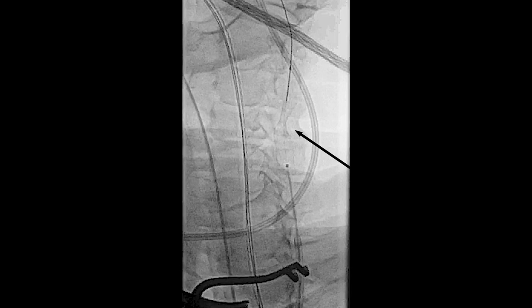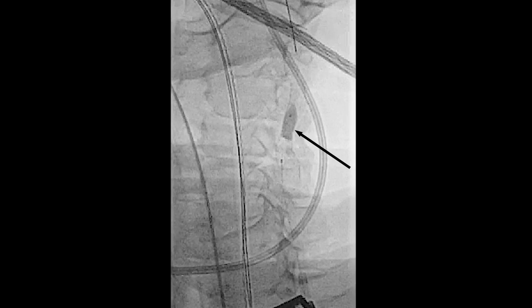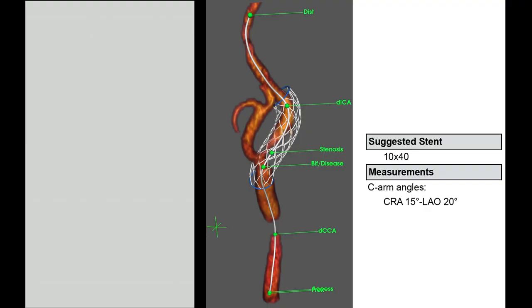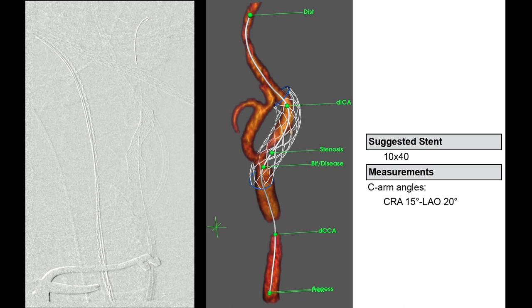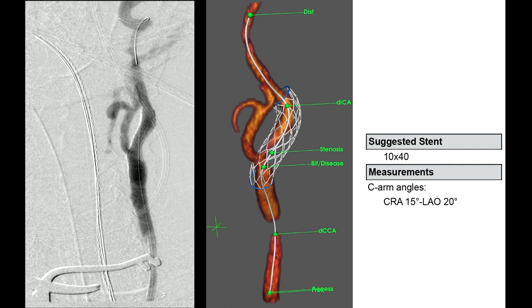Post-dilatation was performed with a 6x20 mm balloon. The proximal end of the stent reaches into the common carotid artery; we had to cover this portion since the lesion extended here. The completion angiogram showed a good morphological result.